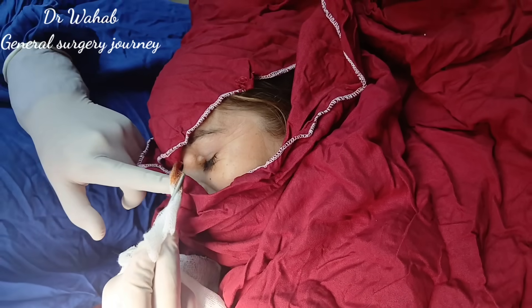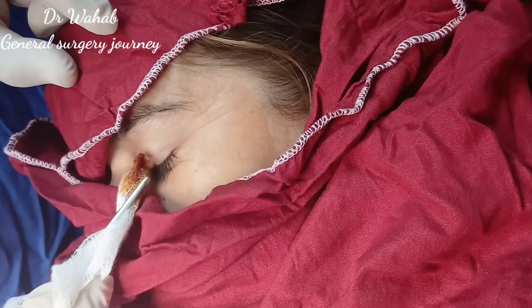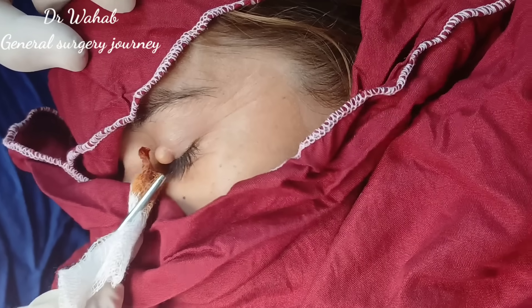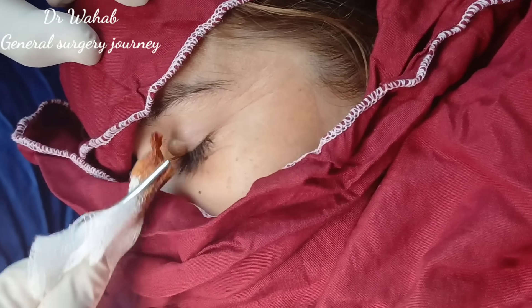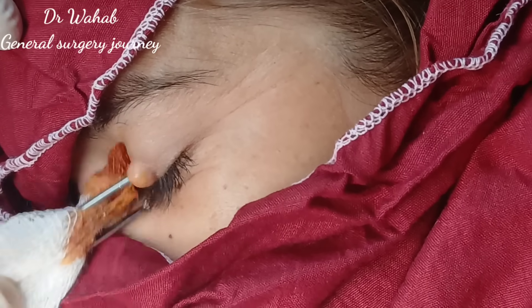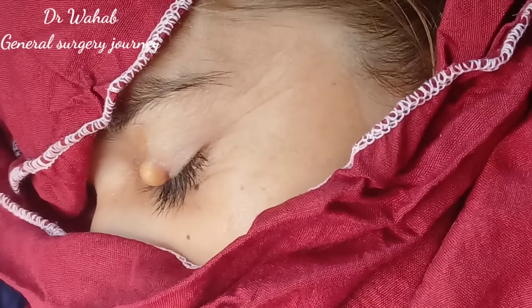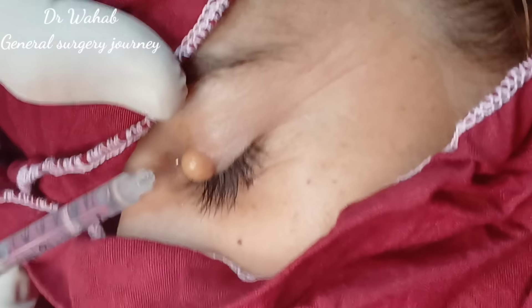Hello dear colleagues. Today we will be performing the excision of the upper eyelid cyst in a 22-year-old female patient who presented with the chief complaint of painless swelling on the left upper eyelid.